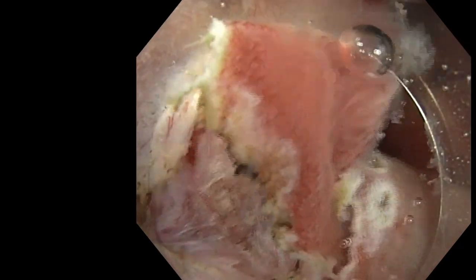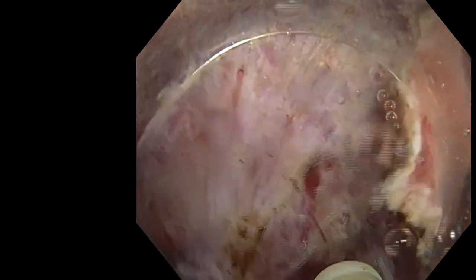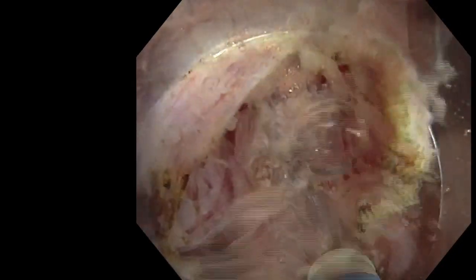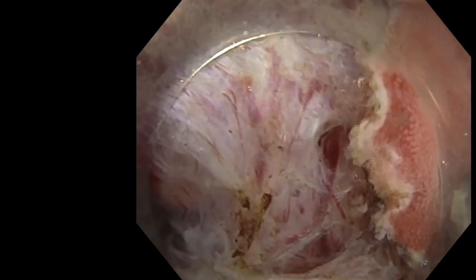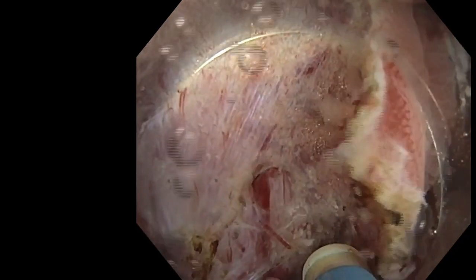but we still have to open this area on the edge of the diverticula with a second diverticula in the right part of the lesion. So here you can see we take fiber by fiber very slowly.